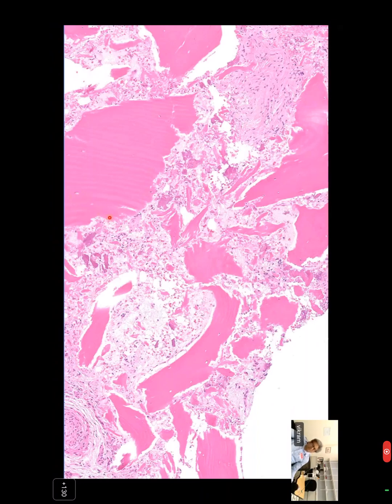It's very unlikely to be dead bone because dead bone has that rat-eaten appearance typically. Spicules of dead bone, particularly those that come out from osteomyelitis, typically have a rat-eaten appearance. This doesn't have that rat-eaten appearance. So one assumes that this is just over-decalcified bone.